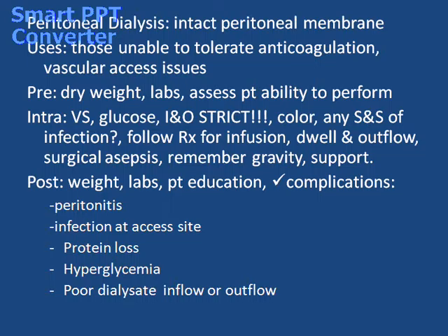It is often used for clients who are unable to tolerate anticoagulation and have difficulty with the vascular access. So what we want is for our patient to have desired fluid balance.